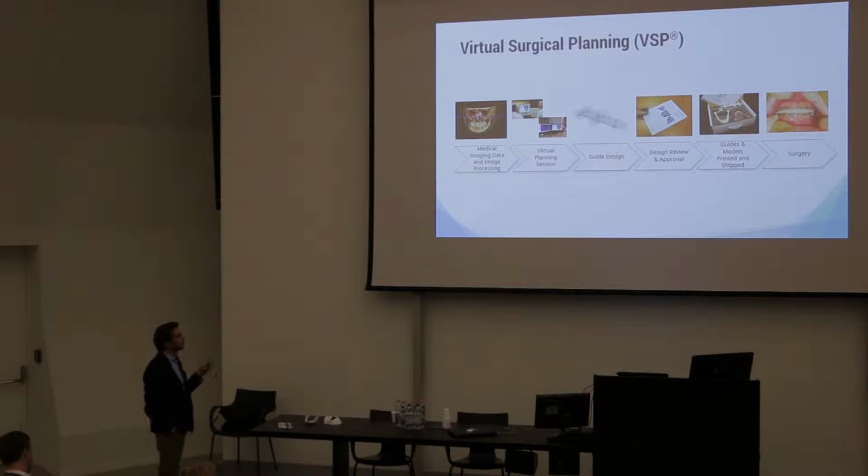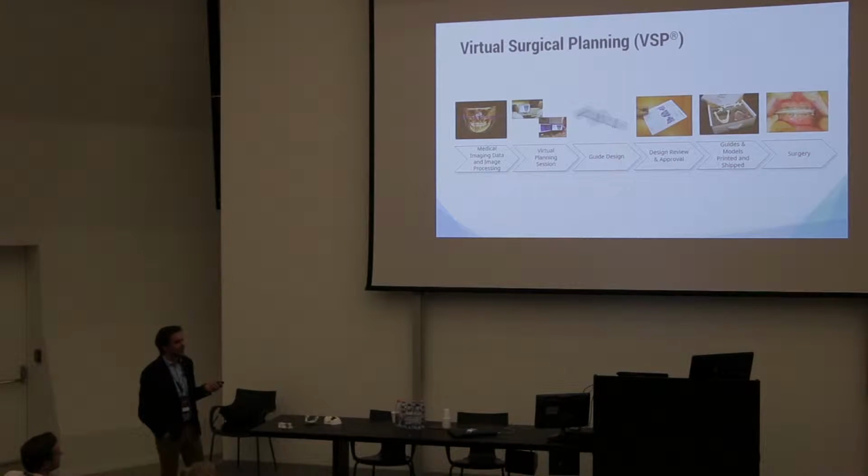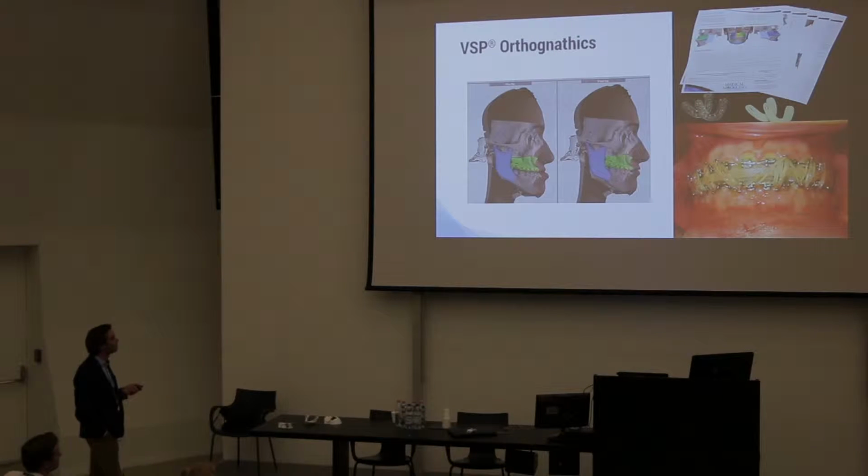And as this complete procedure, with all the guides that are designed along every step of the way, is a 510K approved procedure, this complete virtual surgical planning is actually valid to use as a surgical tool in itself. And these models can be taken into the OR to perform the operation. Two examples of these, which are pretty interesting, are orthognathic cases, where we will do repositioning of the top and the lower jaw of the patient.